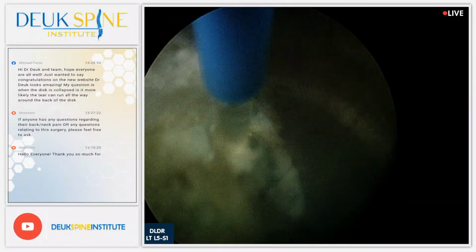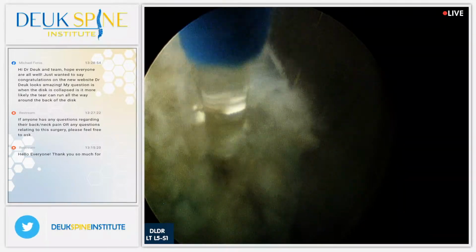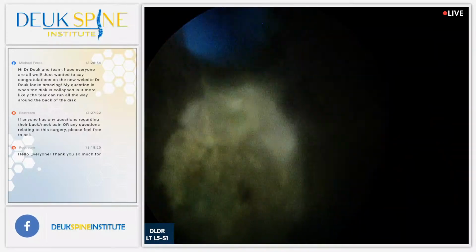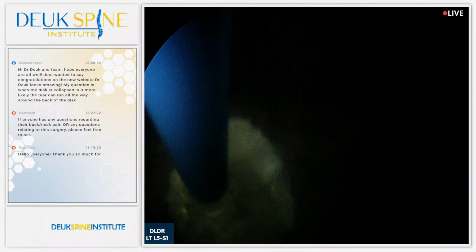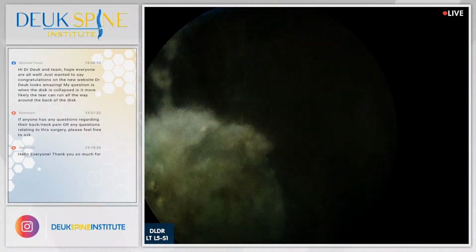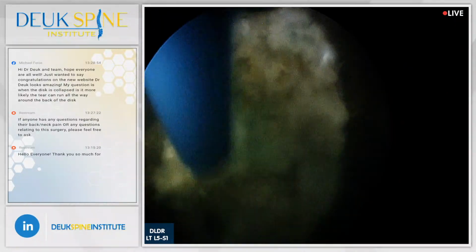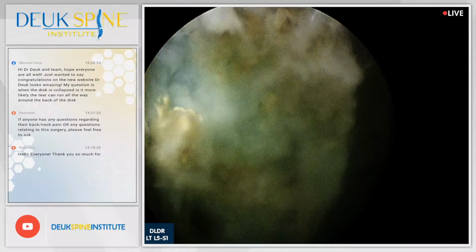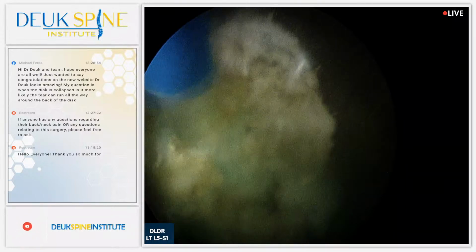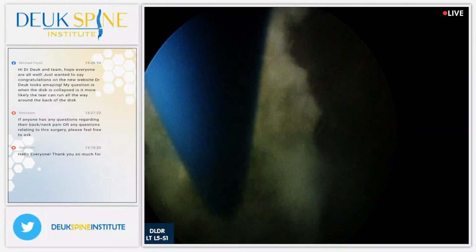And so what I'm doing here is I'm coming in with a laser, cleaning the tear, getting rid of the pieces of herniation that are stuck in the tear that are causing the inflammation, which causes irritation of nerves. The inflammation is causing the back pain by irritating fine, small nerves located in the back of the disc. These are branches of what's called the sinuvertebral nerve. Now the sinuvertebral nerve is what's responsible for back pain and neck pain when you have an injury to a disc. We're going to show you now a video that explains how the laser can be used to debride the tear. It's called an annular debridement.